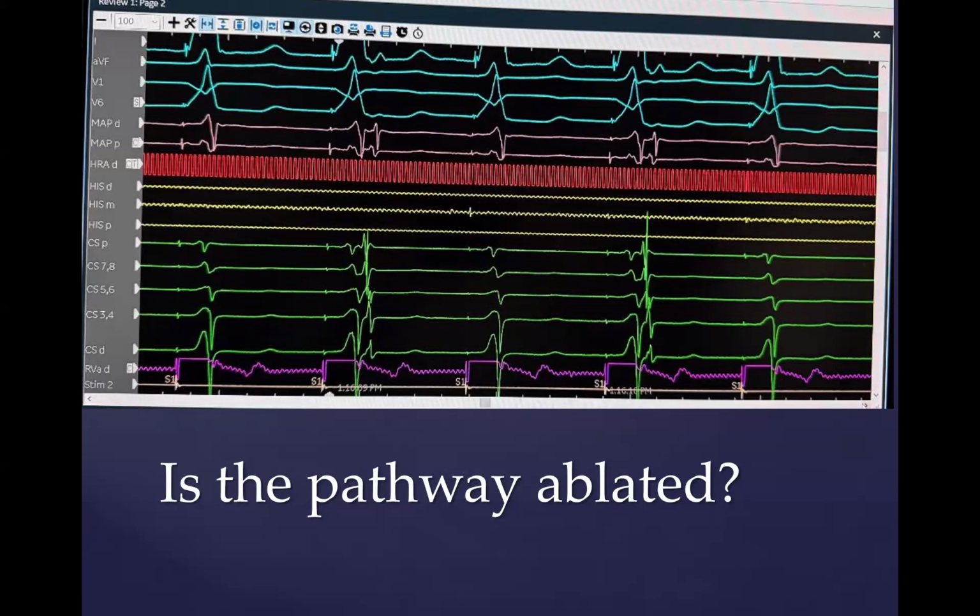So if you have a catheter in the coronary sinus and you have a very good signal, if you turn on RF, if you set the system for a maximum of 50 watts and a temperature of, say, 70 degrees, what happens is it hits 70 degrees with almost no power at all because there's nothing cooling the tip of the catheter. So you can set it at 70 degrees, and basically at 2 watts of power, it'll achieve 70 degrees because nothing is actually cooling it.